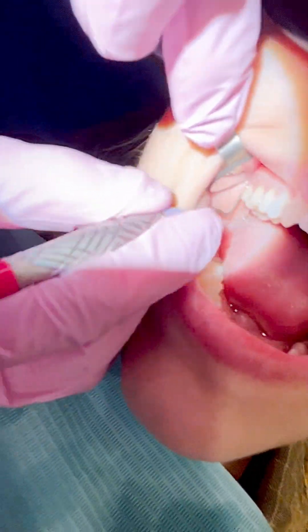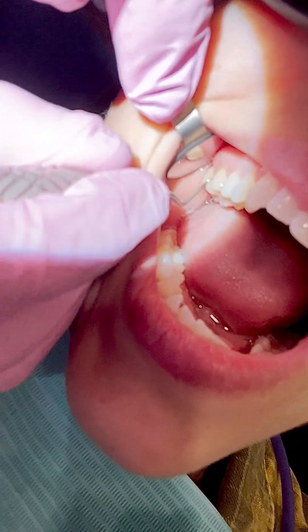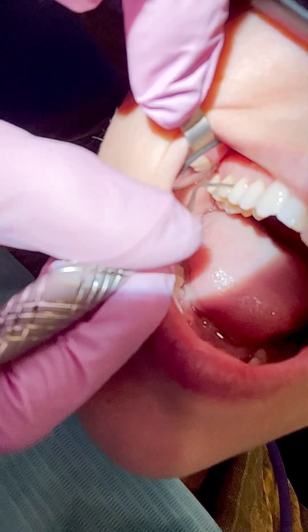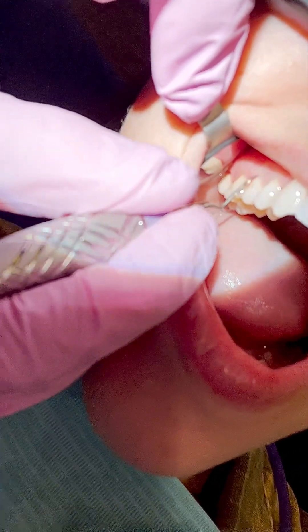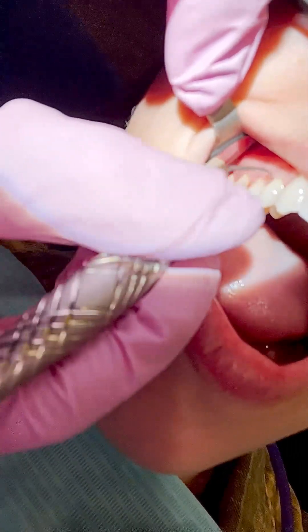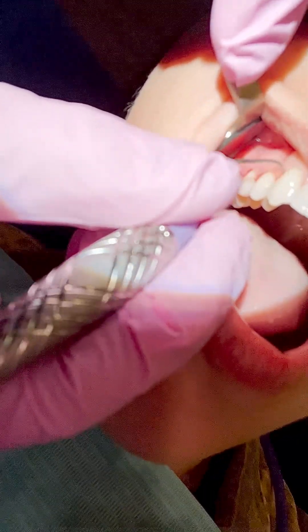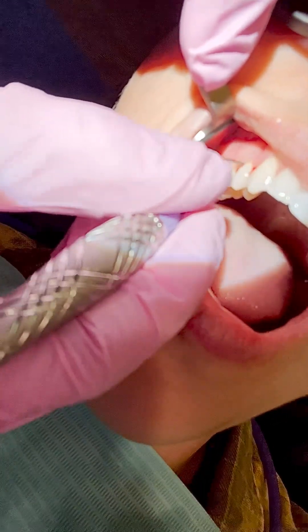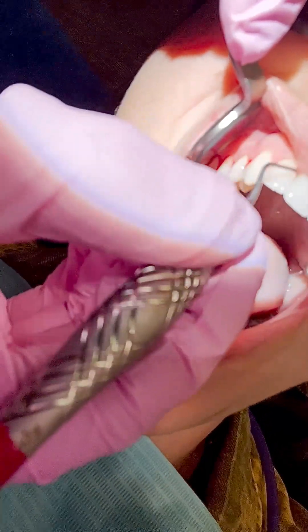I'm starting off on the distal buccal of number two. I go vertical, oblique strokes, horizontal. I go into the contacts. You'll notice I'm always getting the distal line angles — that is the number one place missed with most scaling. They're very good at getting in between and getting the facials, but make sure you're getting the distal buccal. There is a concavity on the first premolar, so really roll into that area. I spend extra time on premolars — they're the number one missed teeth, especially the lower premolars.